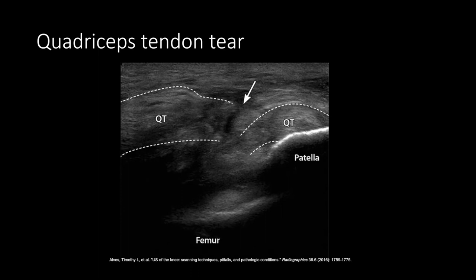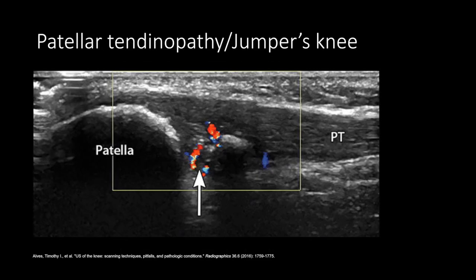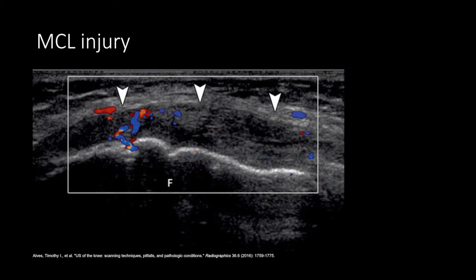This is a full thickness quadriceps tendon tear. The longitudinal view shows a hypoechoic defect between the proximal and distal stumps of the quadriceps tendon. This is a longitudinal color Doppler view of the patellar tendon which shows thickening, heterogeneity, and hyperemia of the proximal patellar tendon. This is a long axis color Doppler view of the MCL where you can see thickening, increased vascularity, and hypoechogenicity denoted by the arrowheads, consistent with a sprain.